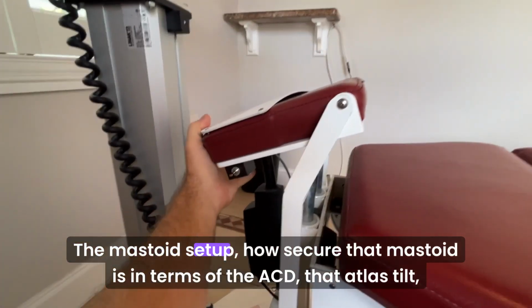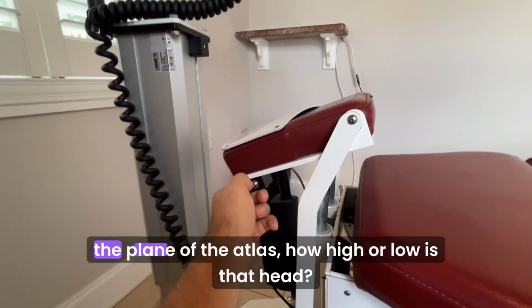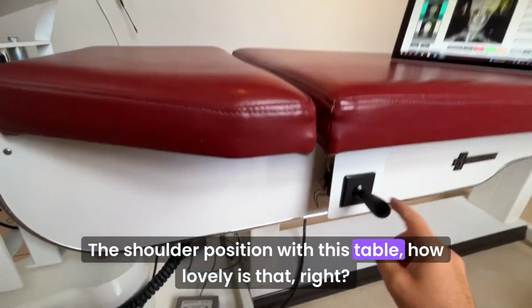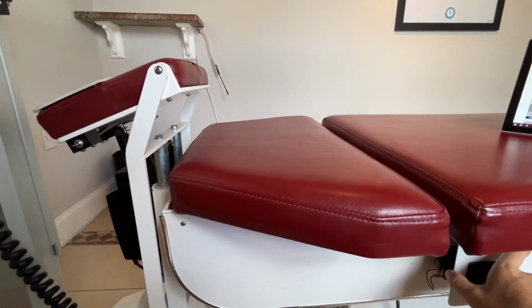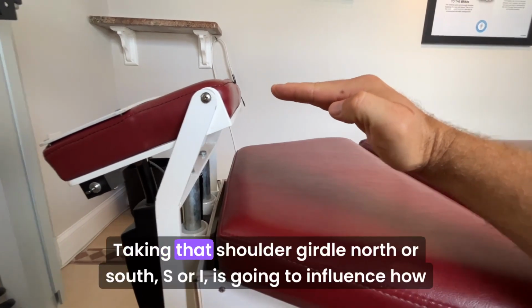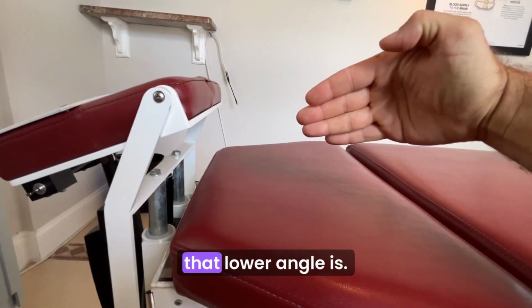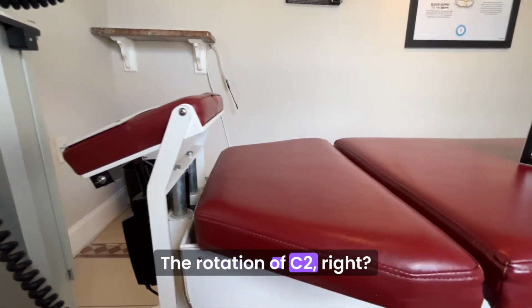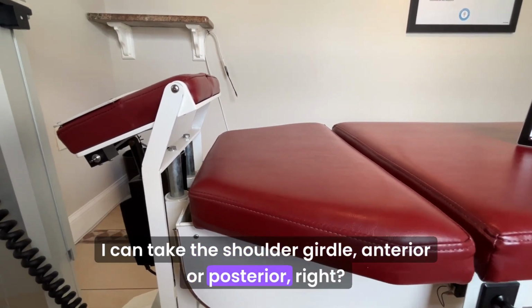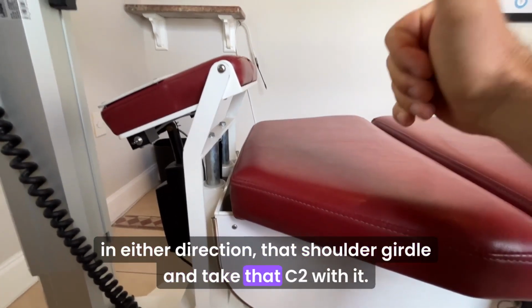The mastoid setup, how secure that mastoid is in terms of the ACD, that atlas tilt, the plane of the atlas, how high or low is that head? The shoulder position with this table, how lovely is that, right? This is going to address that lower angle, right? Taking that shoulder girdle north or south, S or I, is going to influence how that lower angle is. The rotation of C2, right? I can take the shoulder girdle anterior or posterior, right? Which is going to take and rotate in either direction that shoulder girdle and take that C2 with it.